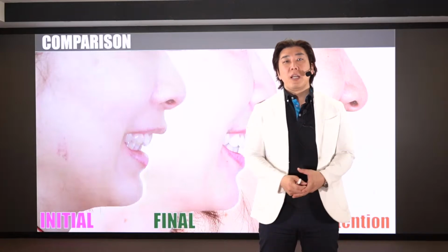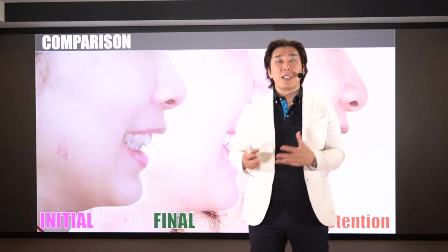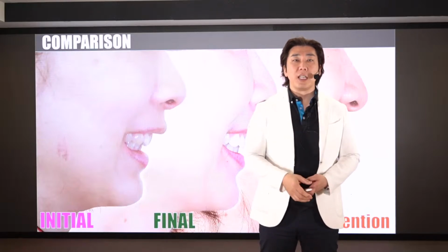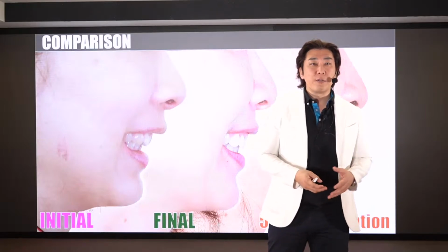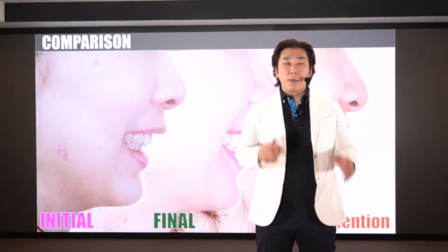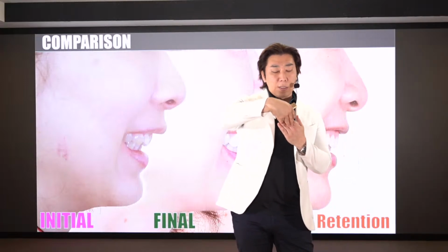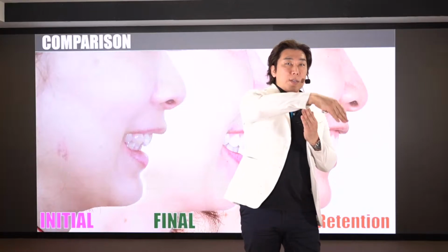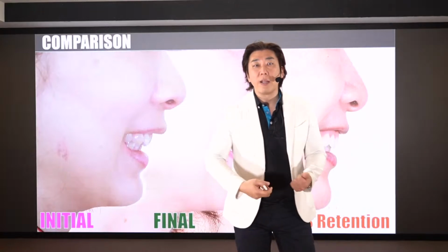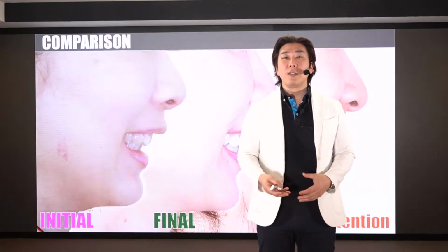The patient is repositioned, so there is a new position. Sometimes CO and CR are different. Sometimes your patient's condyle changes just a little bit. After that, taking a scan is easier to create your patient's ClinCheck, or the initial time is the same as this patient. Initial ClinCheck only focuses on upper anterior teeth, like this. After that, change your patient's mandible, then rescan again. Replanning is more predictable treatment planning and easy to control for the patient.